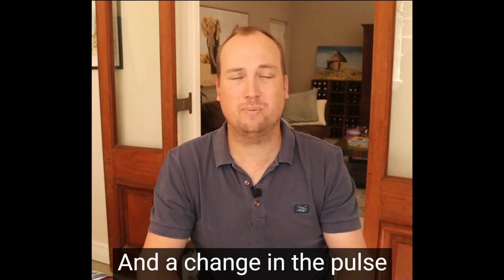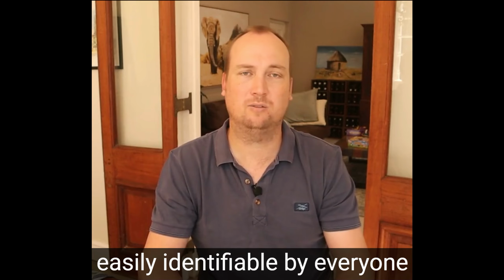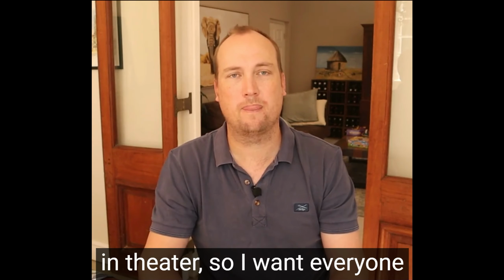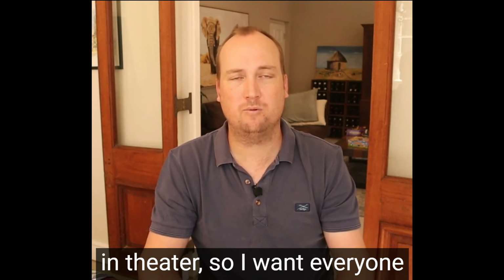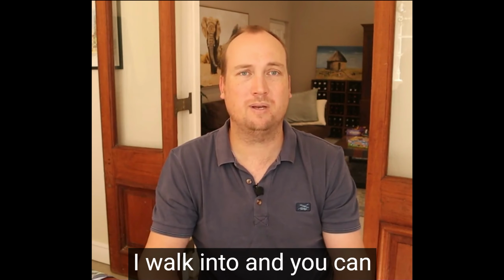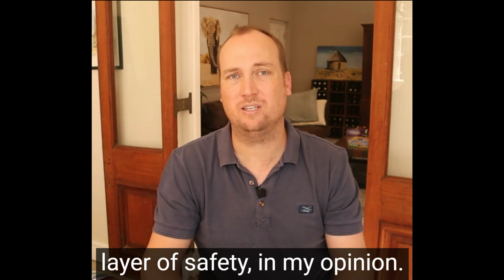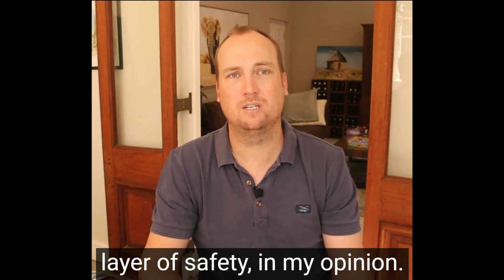And a change in the pulse oximeter tone is rapidly and easily identifiable by everyone in theatre. So I want everyone to be able to hear that. There's some theatres that I walk into and you can barely hear any monitors. You've just removed a big layer of safety, in my opinion.